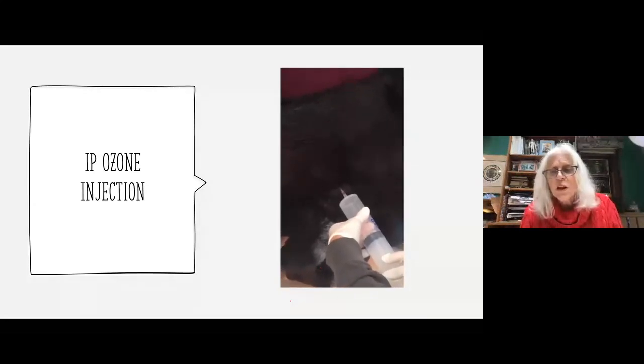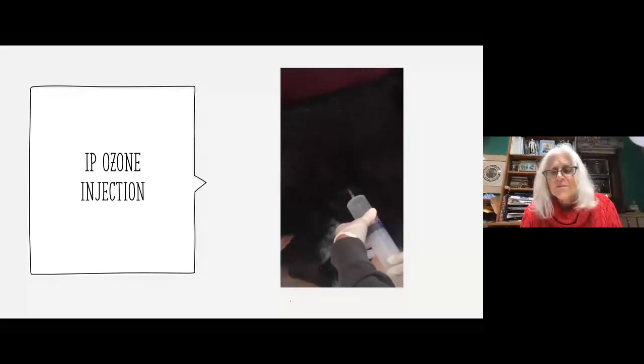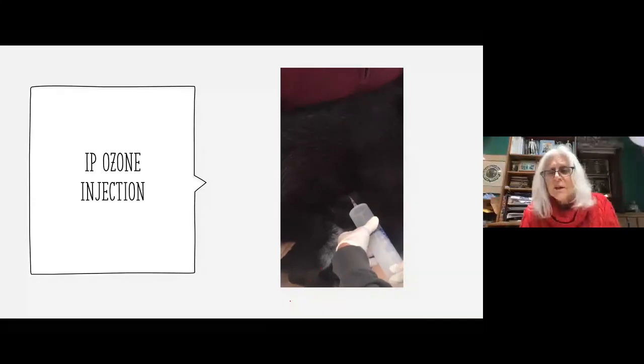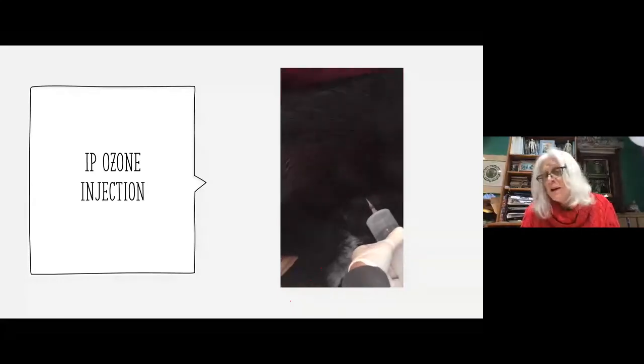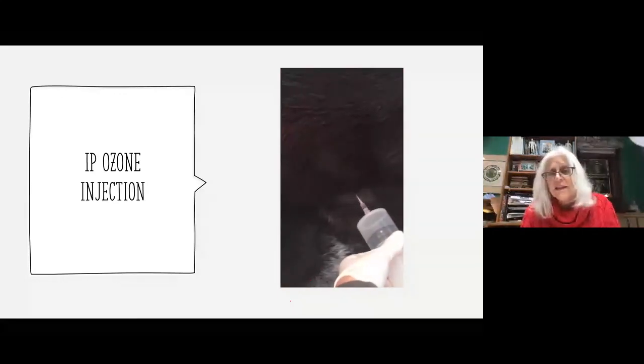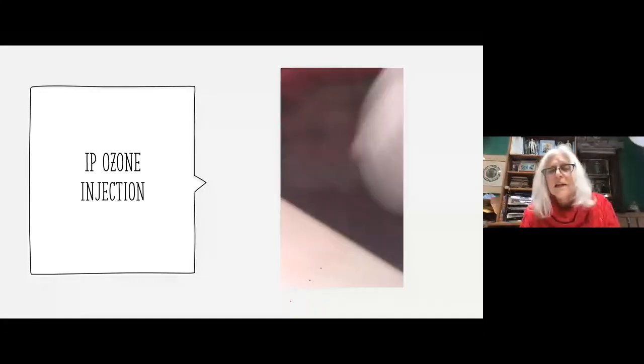And again, you can go slow in the beginning, and then once you sort of get in there, it can kink a little bit. I'll try to pull it out a little bit because sometimes I'm pushing on it and it's kinking the syringe. So I'm pulling it in and out a little bit. So again, he had multiple IP injections. He also had hyperbaric, and his liver having to function. Push a little bit to get it going. It seems to be grabbing onto something. Yeah. So you can feel the body sort of pushing back on it.